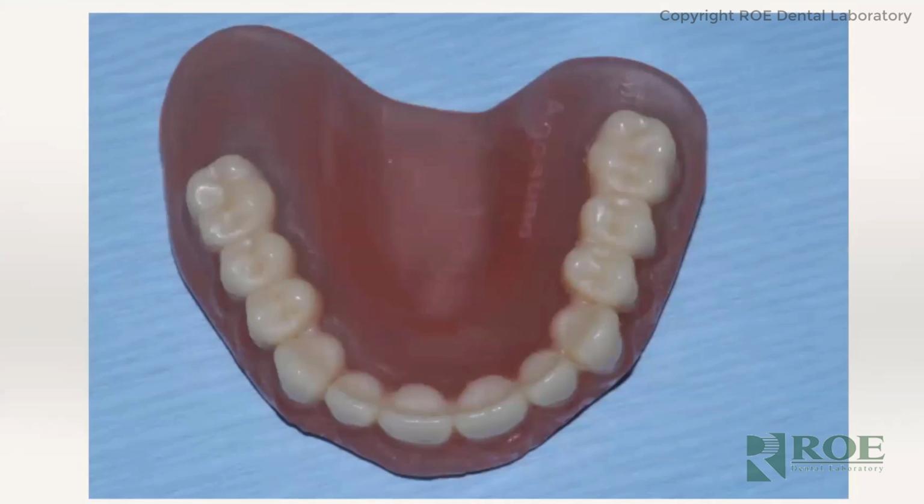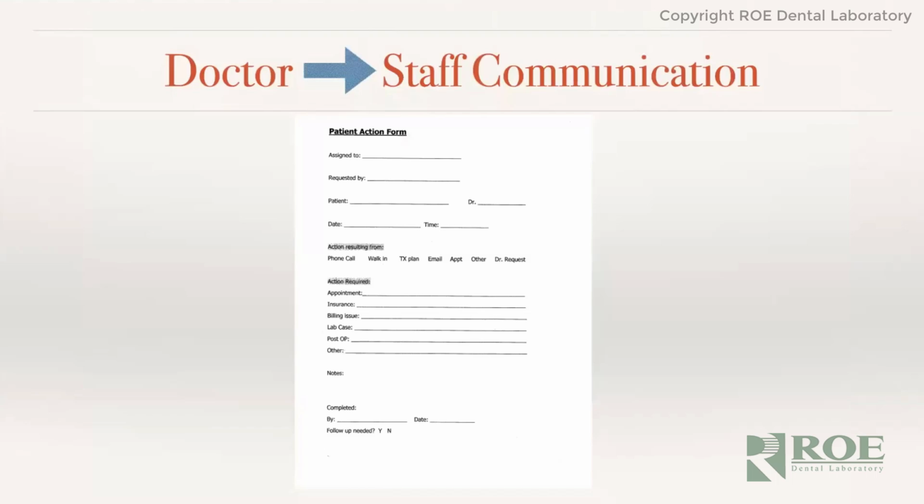For any maxillary case, I always have a backup denture just in case. I've had 3 cases in the past where the bone was so soft we were barely able to get 20 on the tightest implant, and I decided it was in the patient's best interest to go with a maxillary denture. Not having this, I can't imagine what I would have done or said to the patient afterwards. And I always let them know this is going to happen.